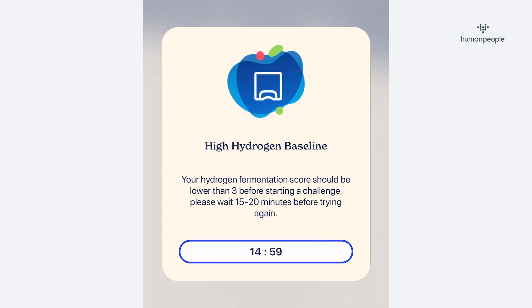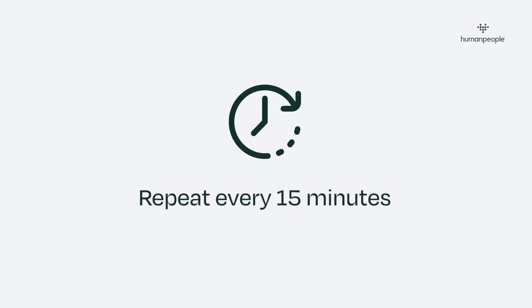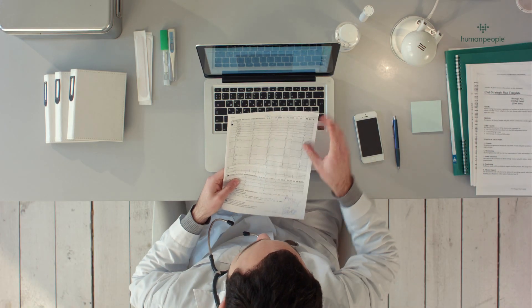Once complete, you can release the button. If your test sample is okay, you can continue on to the main test. If not, there will be instructions on how to repeat it. After a short interval, you will be prompted to take the lactulose solution you prepared earlier and begin the test. You will continue to provide samples every 15 minutes until the test is complete, where all your results will then be sent through to HumanPeople for analysis. If you have any questions, please don't hesitate to get in touch.